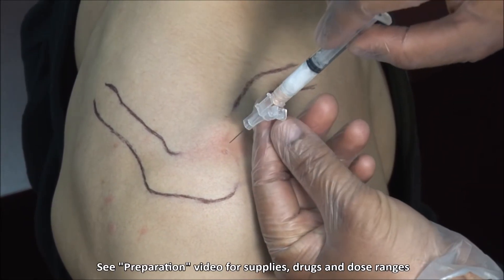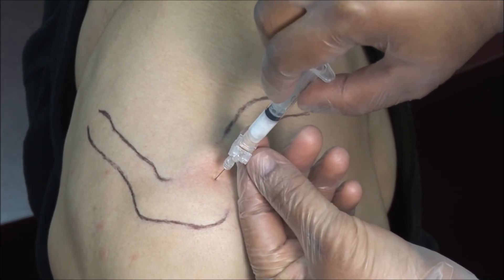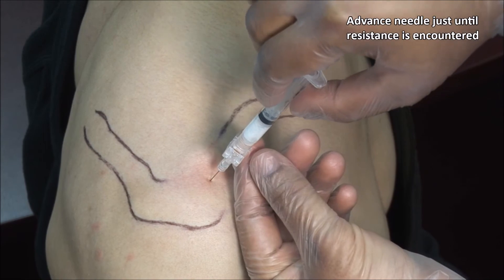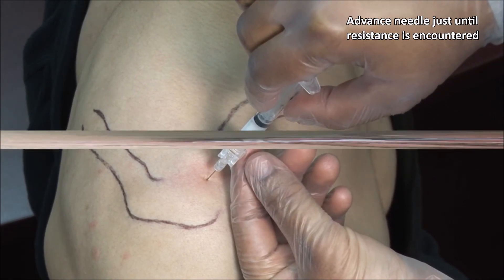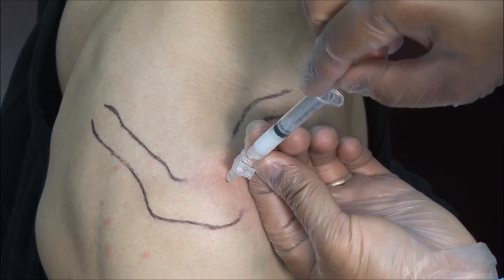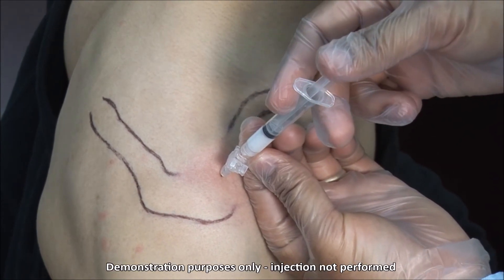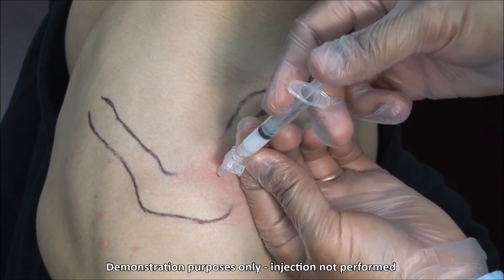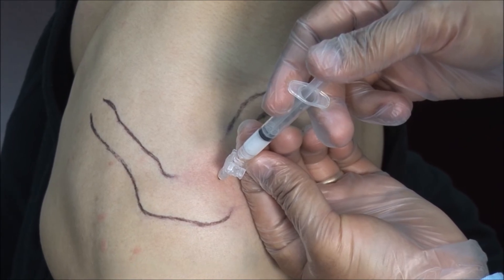Advance the needle through your point, directed inferiorly and posteriorly, just until resistance is encountered. Always aspirate to ensure you are not in a blood vessel. Then inject the solution. This should go in fairly freely but may be tense compared to other joints, as the AC joint is rather small.